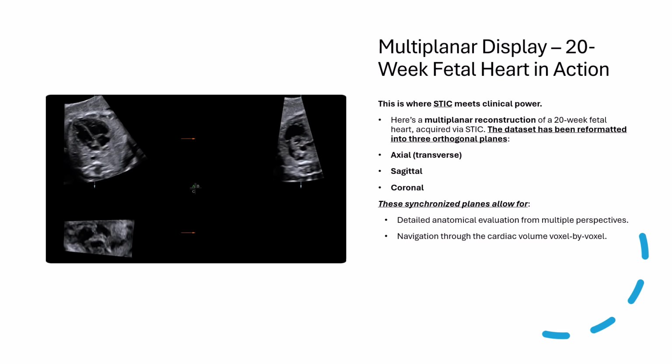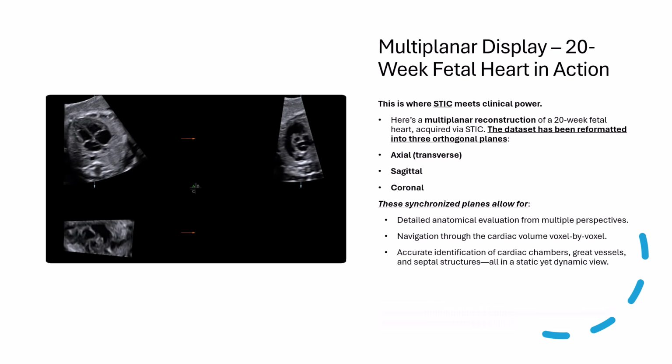We can achieve an incredibly precise assessment of the heart structure. From here, we can accurately identify critical components such as the cardiac chambers, great vessels, and septal structures, all of which are clearly visible in a static yet dynamic view.